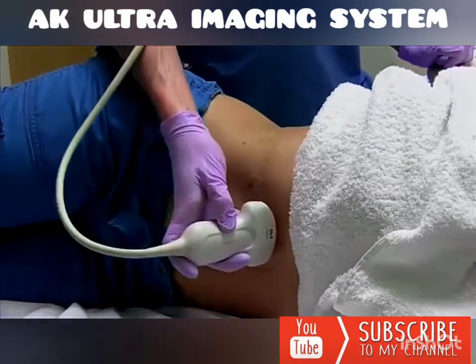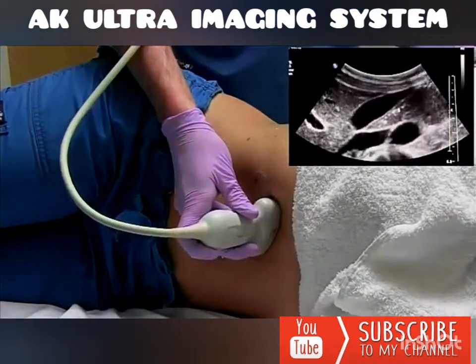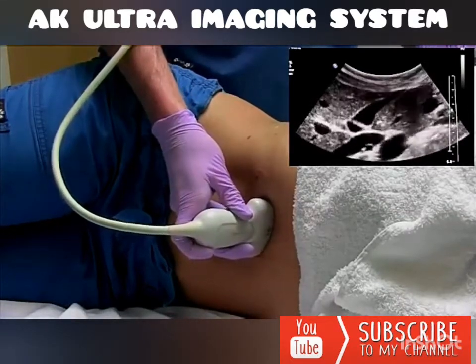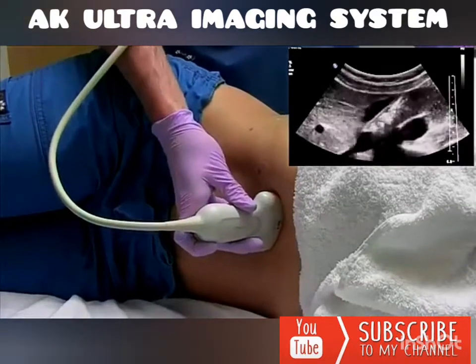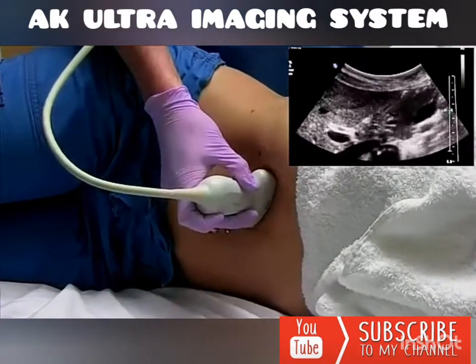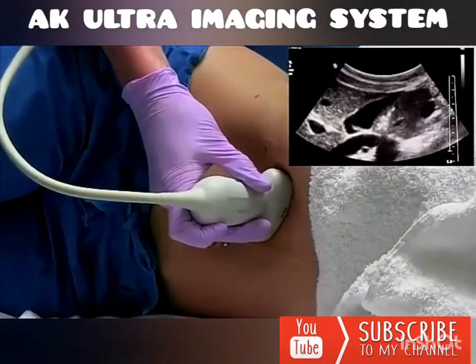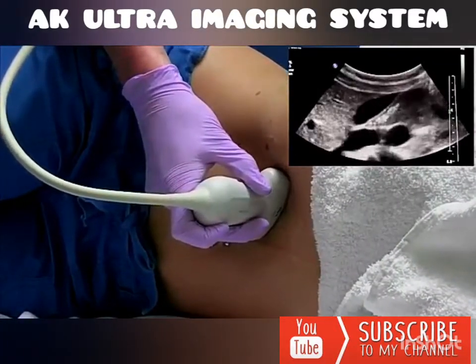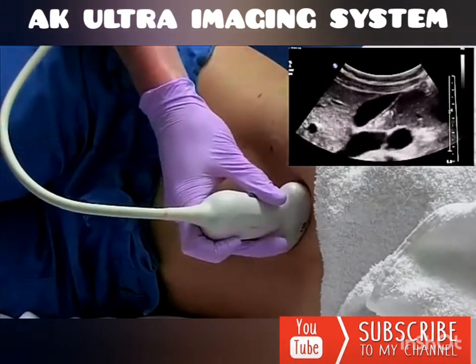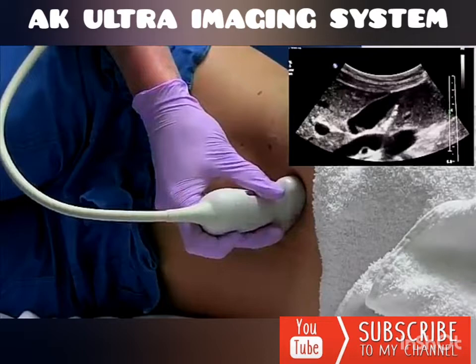So we're going to come subcostal here and just sweep through, and you should see the gallbladder very anterior here. I like to start in a sagittal plane from here. You just want to make sure you sweep through the gallbladder, and if there are any stones, they should drop into the fundus of the gallbladder from this plane. This is also good for opening up the neck of the gallbladder to make sure there's no stones impacted in the neck.